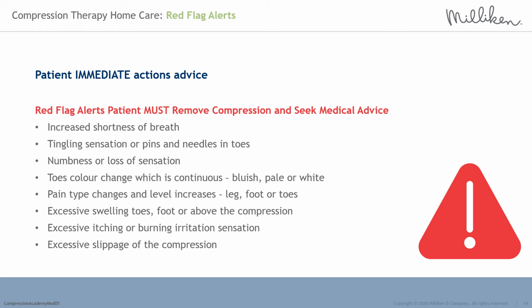Pain type changes and level increases in the leg, foot or toes. Excessive swelling in the toes, foot or above the compression. Excessive itching or burning irritation and sensation. Excessive slippage of the compression.